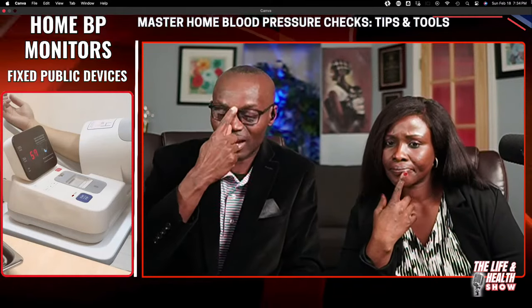Yes, there's another group of blood pressure monitors. And this one I see at my place of work all the time. This is the standalone fixed public devices, which you can find in pharmacies, grocery supermarkets, and airports. Sometimes it may be country specific. It may just be in the U.S. I'm not sure how it is in the European Union or in some other countries.